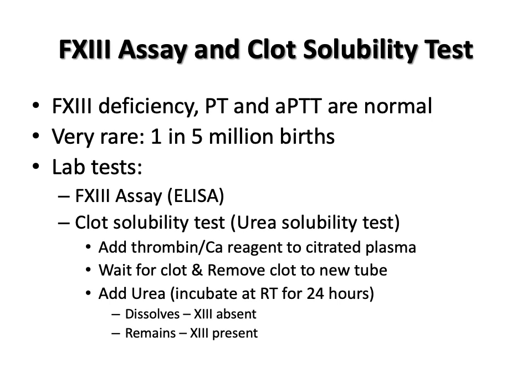Factor 13 deficiency is very rare, occurring in only 1 in 5 million births. Patients that have a factor 13 deficiency will have a normal PT and APTT. Therefore, the typical procedure used to test for other factor deficiencies will not work here. Factor 13 deficiency can be tested for by ELISA or by the following procedure.